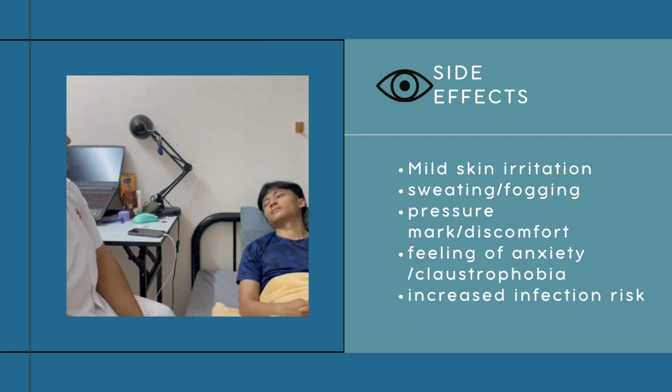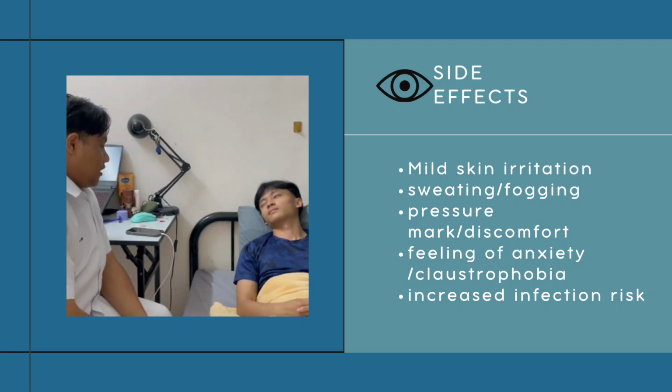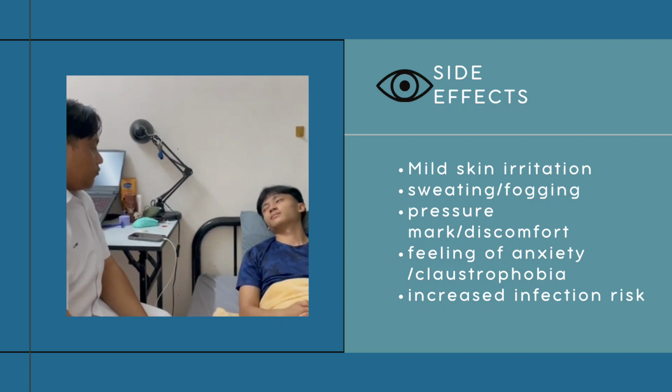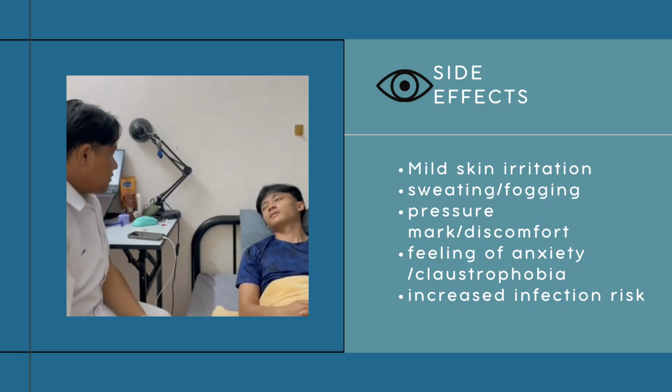Right. There are some side effects when you are using an eye shield. The first side effect is it may cause some mild irritation due to the tape. Some patients are allergic to the tape, but I wish you are not allergic to the tape. I assume. Yes, I should be fine, no problem. The other one is when you are using it for a long duration, it might cause discomfort because it might have some water retention or it will block the film.